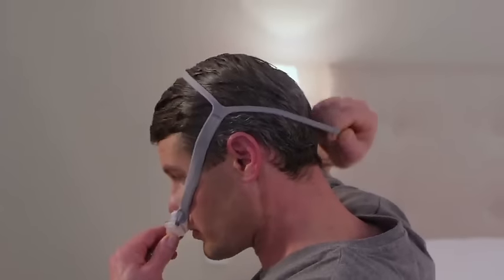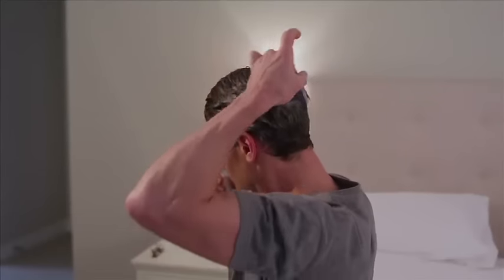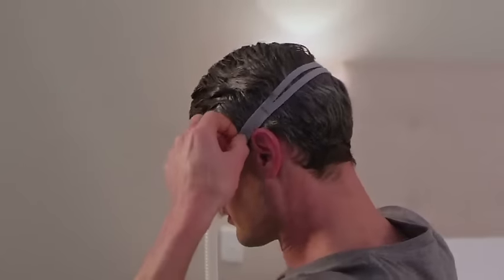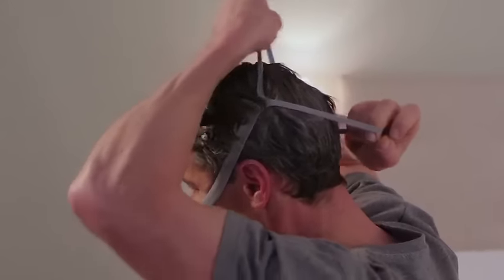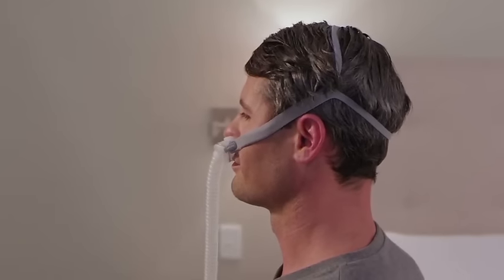To get a comfortable fit, adjust the QuickFit Split Straps by drawing them closer together to tighten, or by spreading them apart to loosen. By adjusting like this, you can achieve a great seal and a comfortable night's sleep.